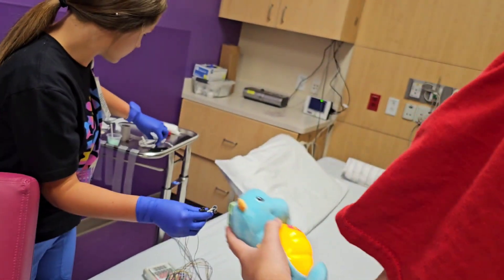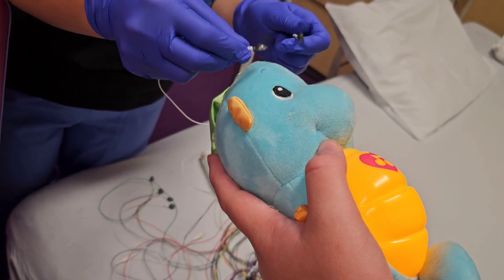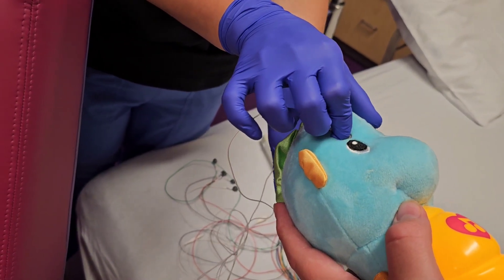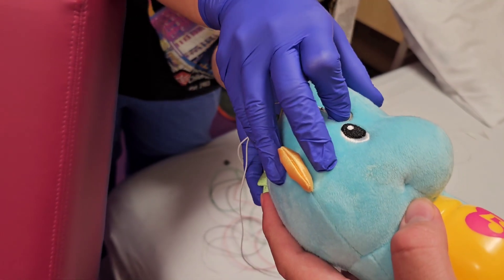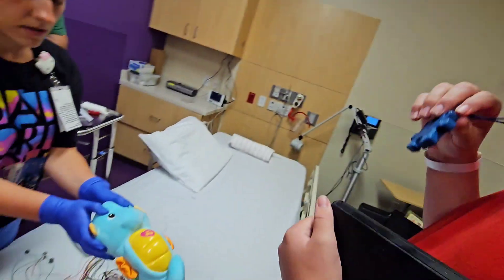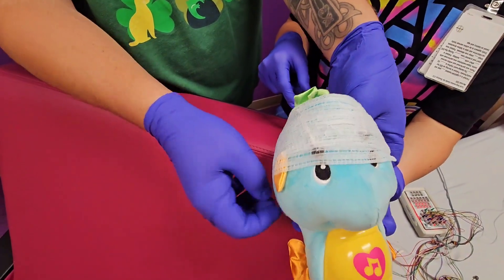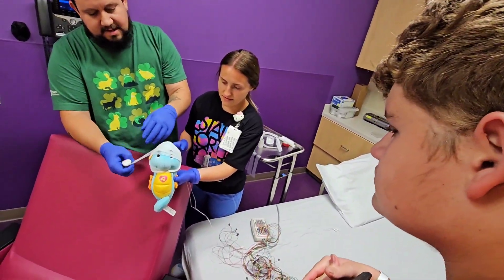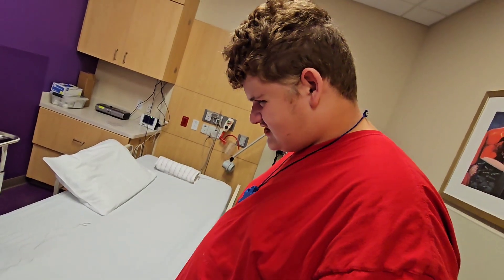Watchers, watch what they do — they stick it on just like that, and we can even wrap it. Look at that, a little wrap on there. What's the dino — what is it? Yeah, it's a seahorse! What's the seahorse's name, do you have a name for it? I don't think they ever really named it. We're gonna put the buttons on and then wrap just like this, and they hold them on just like this, this little hat. What do you think buddy? That's fun! Look at that — yay! Glow worm, okay, glow worm's ready. JJ's turn!